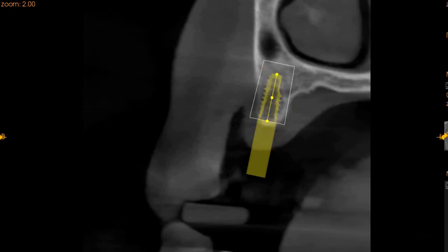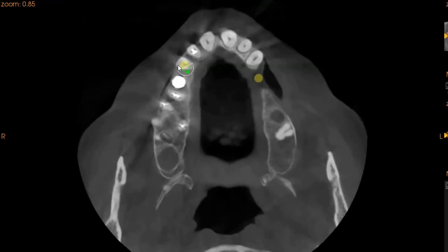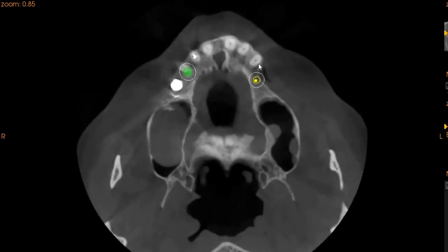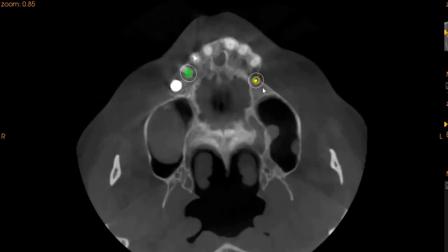The implant can be placed well centered. If I can show you the axial view in this region — in the axial view, this is where the implant will be placed. This is the first premolar region where we have a buccal defect. So, it will also need to be placed more palatally, but if placed at these angles, the implant will have good engagement in the bone.